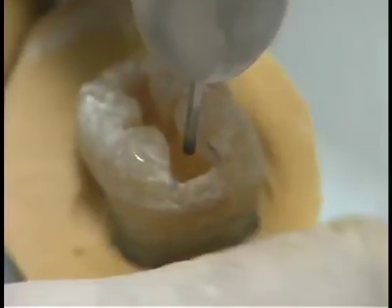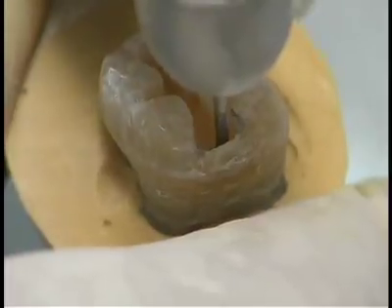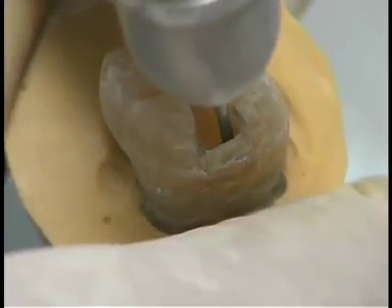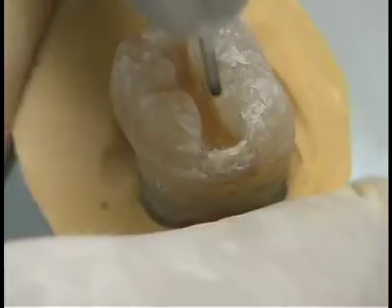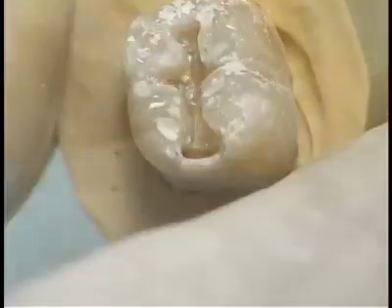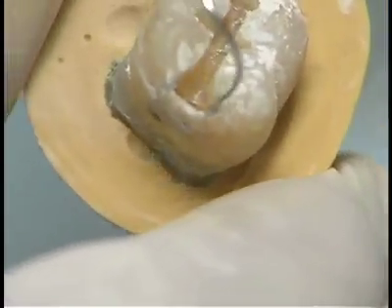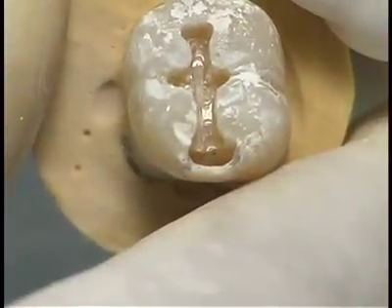The initial step in preparing the proximal segment is to place the cutting end of the burr on the DEJ, 1/3 in dentin and 2/3 in enamel. Pressure is directed gingivally and lightly towards the enamel shell to keep the burr against the proximal enamel. While the burr is moved facially and lingually along the DEJ, it should be oriented according to the proximal wall directions, occlusopulpally. The burr should also be oriented correctly proximo-axially to visualize the complete mesiofacial and mesiolingual margins at right angles to the proximal surface.